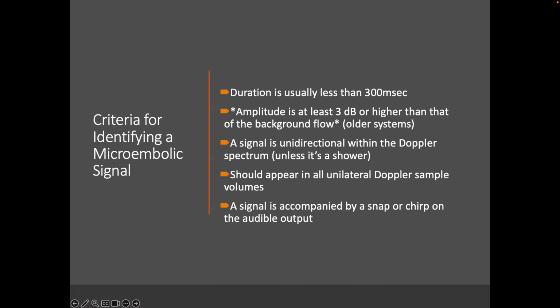The signal should be unidirectional unless it's a shower of microemboli. You'll hear like a snap or a chirp on the audio output. The signal should appear in all unilateral Doppler sample volumes as it travels along the vessel.